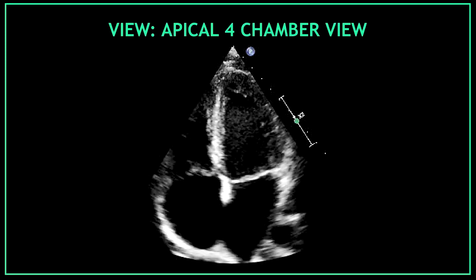Let's start with the apical 4 chamber view. I'm going to show you one by one all the measurements you need to obtain of the apical 4 chamber view.